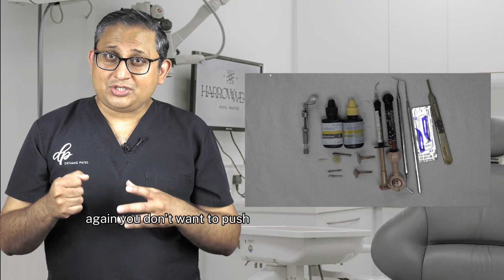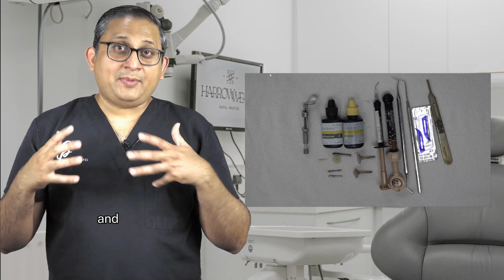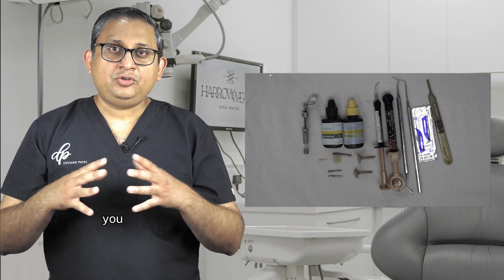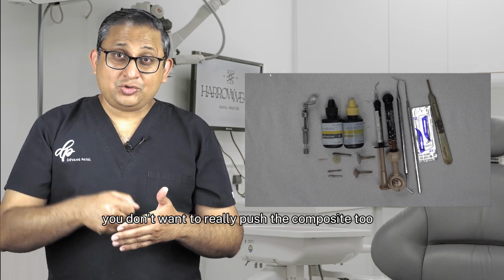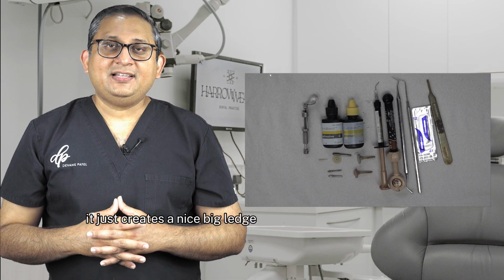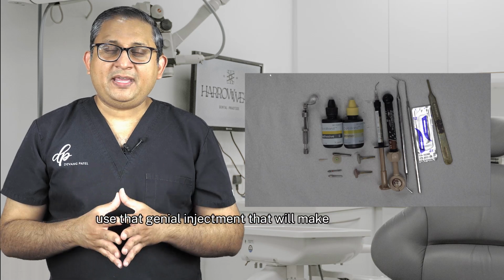Again, you don't want to push it too hard because you're struggling to put the band in, and most of the time you're not going to use a wedge, which we'll discuss in a minute. You don't want to push the composite too hard so that it comes out from the matrix band and creates a nice big ledge. So make sure that you use that injectable, and that will make your life easy.